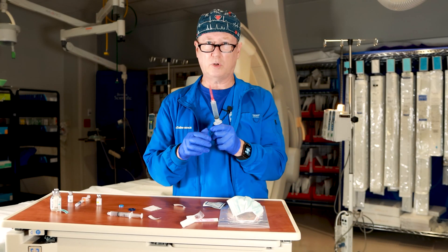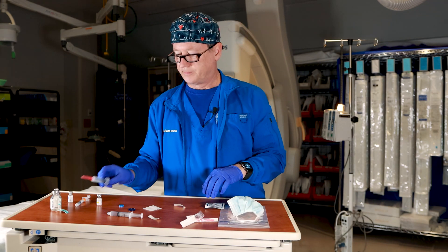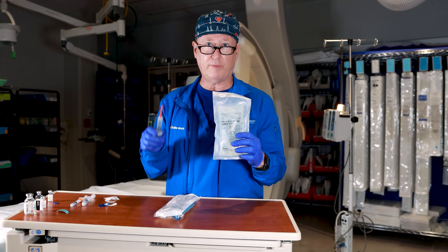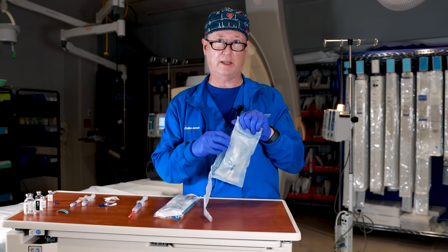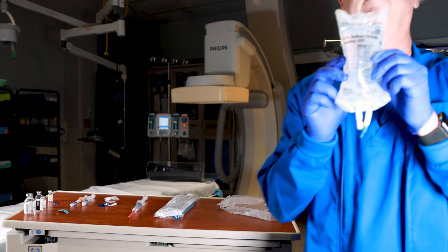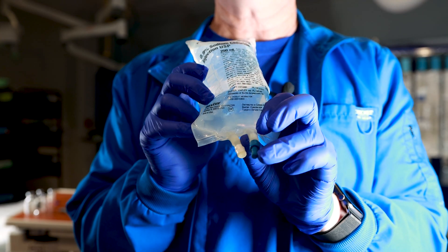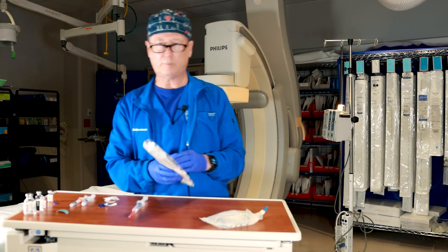In the cath lab, if you draw it up and immediately give it you don't have to label it. Now, how do you give this medication through an IV? You're going to give it through an IV. Every cath lab has patients on saline — this is a 250 cc bag of 0.9% sodium chloride, which is normal saline. It has one port for adding medications and another port where you pull the blue connector off to attach IV tubing.